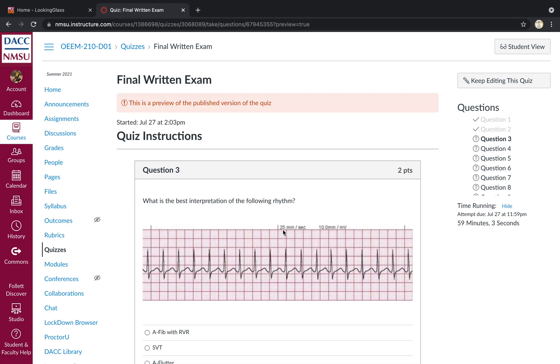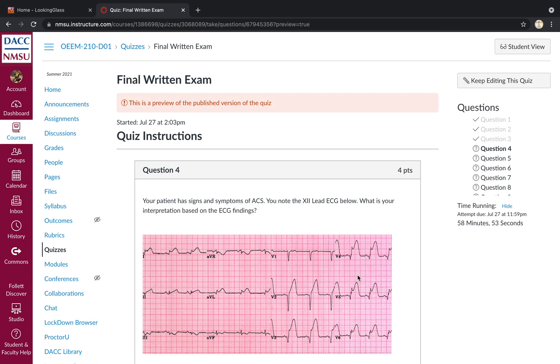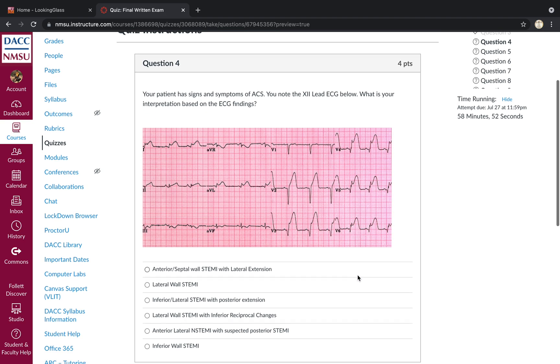What is the best interpretation of the following rhythm? It's a rapid, narrow, and regular SVT would be the best answer there. Moving right along.